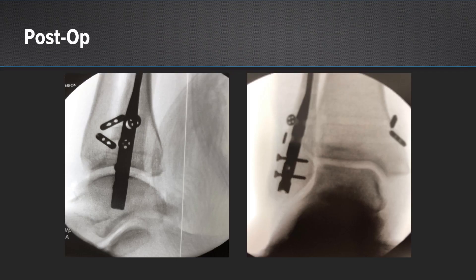This is a C-arm shot showing our immediate post-operative results with an anatomic reduction of the ankle mortise, appropriate placement of the Fibulok nail, and the two tightropes. The two tightropes are at the level of the syndesmosis and approximately one centimeter proximal to the joint surface as well.